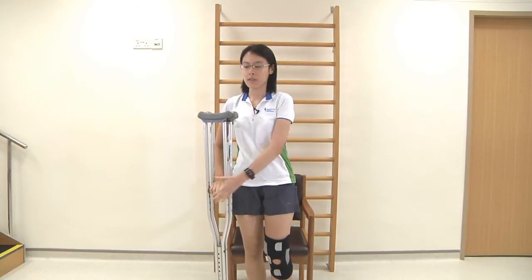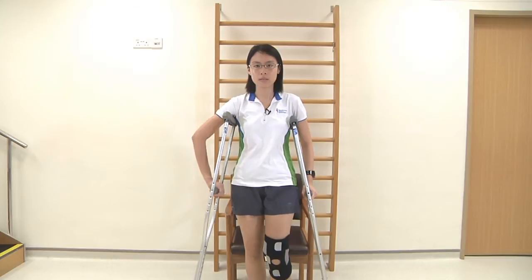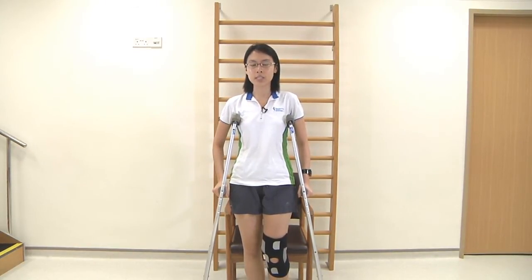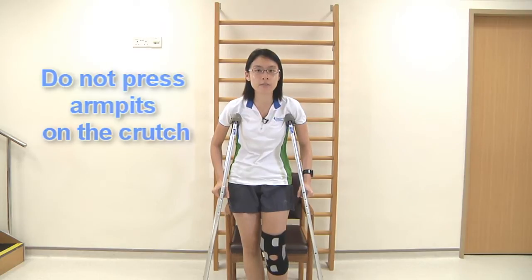Once you have steadied yourself, place the crutches under your armpit. Have the crutches about six inches away from your leg. Remember not to press your armpit down on the crutch to avoid any nerve injury.